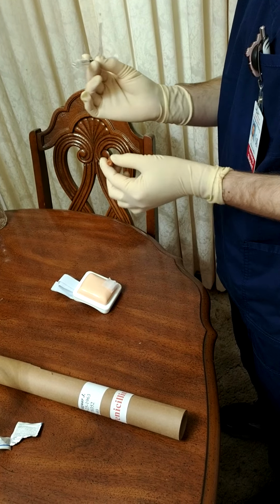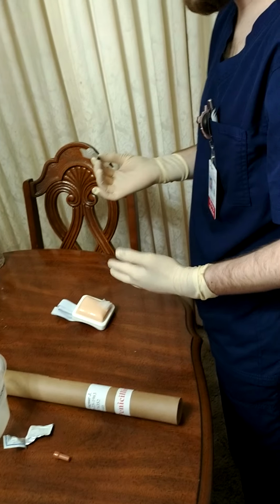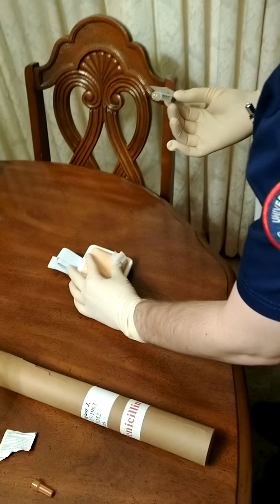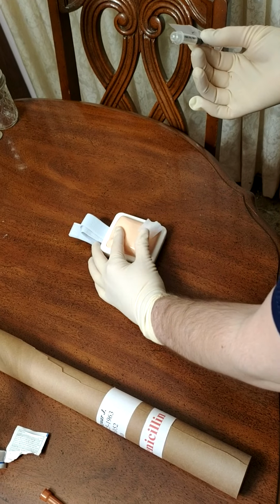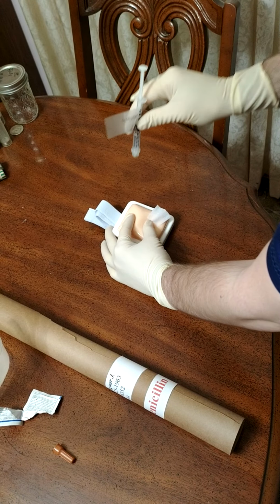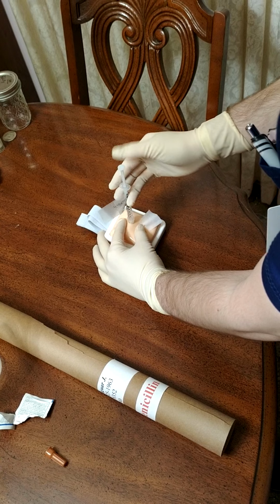We'll carefully remove my cap. Then with a subcutaneous injection, I will pinch the skin, and if there's enough room, I would like 2 inches that I can pinch up. I will then inject at a 90-degree angle.